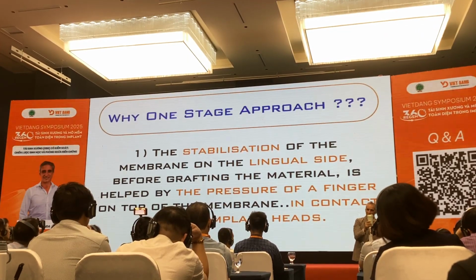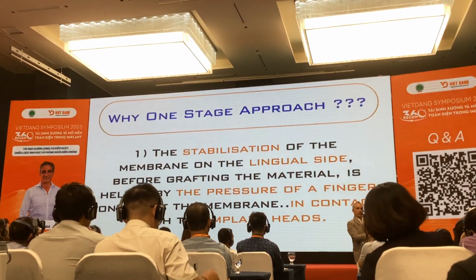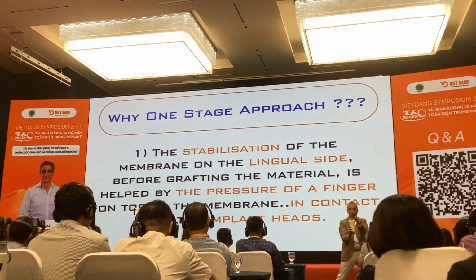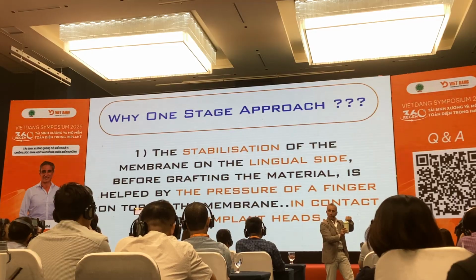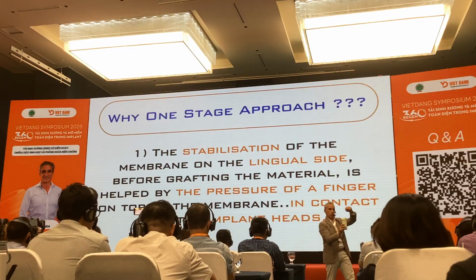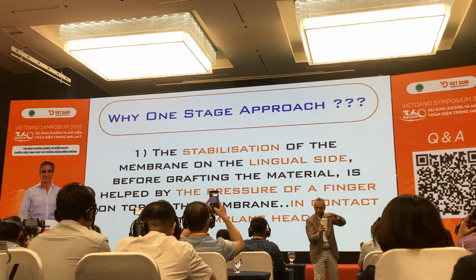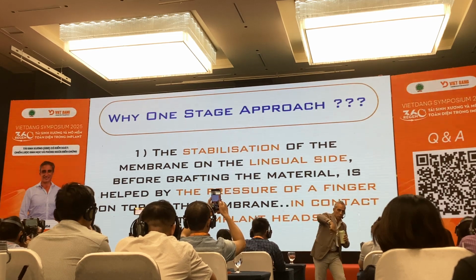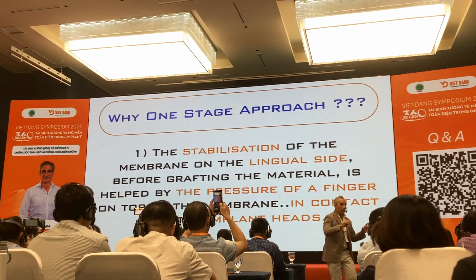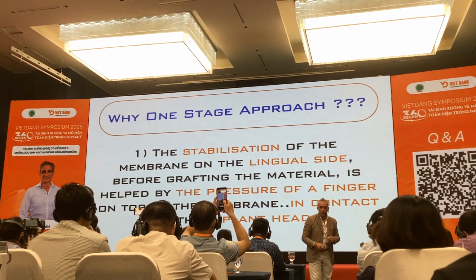Below the membrane there are the heads of the implants. And you manage to define the position of the membrane, and when you find the correct position, you hold the membrane with your finger. And while you are pushing your finger against the membrane and against the heads of the implants, you can fix the membrane on the lingual side, maintaining the correct position of the membrane.